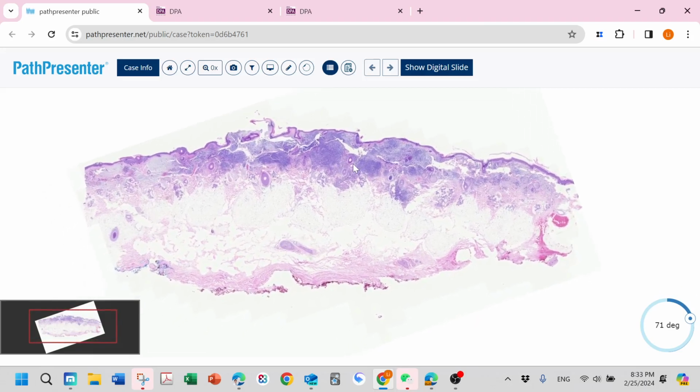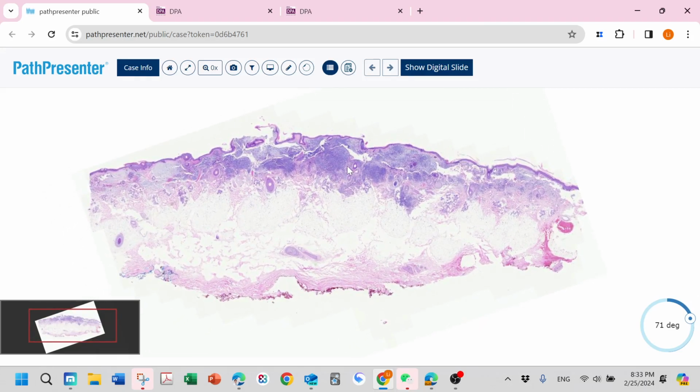And then whenever you see this big, widely excisional sample, you can kind of cheat it. It should be malignancy. If not malignancy, usually you won't get this big chunk of excisional sample. Then you can see big hair follicle go down deep into the subcutaneous, so it should be from the scalp.